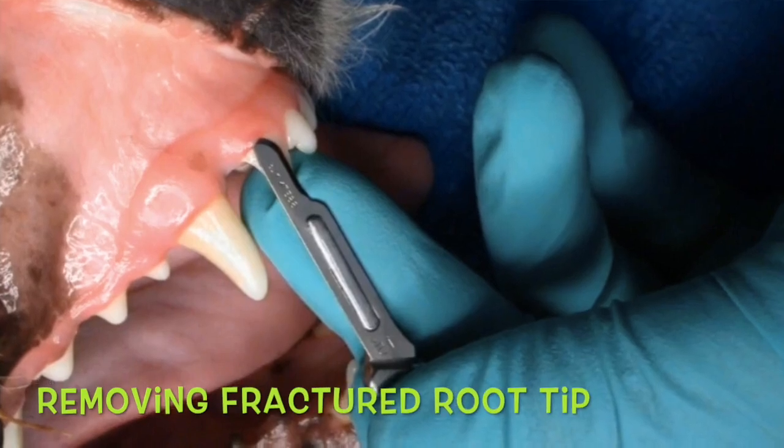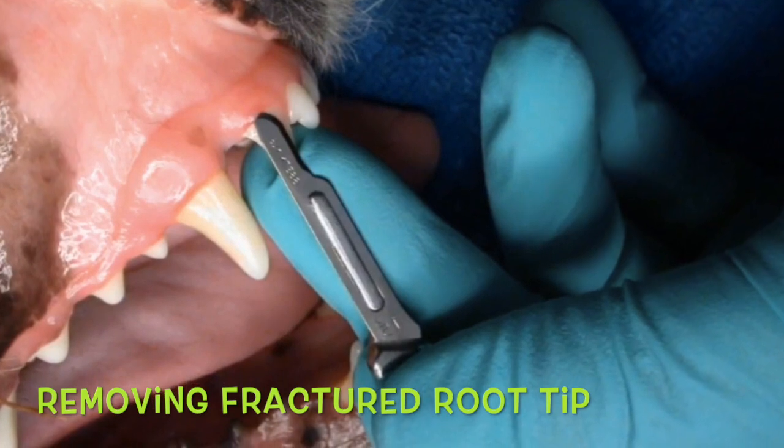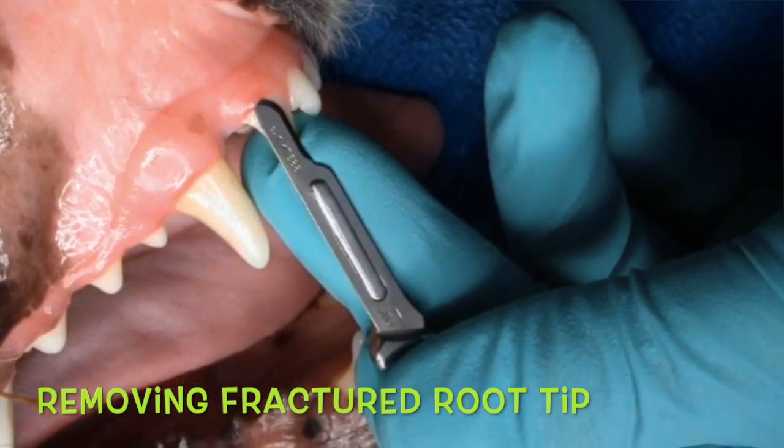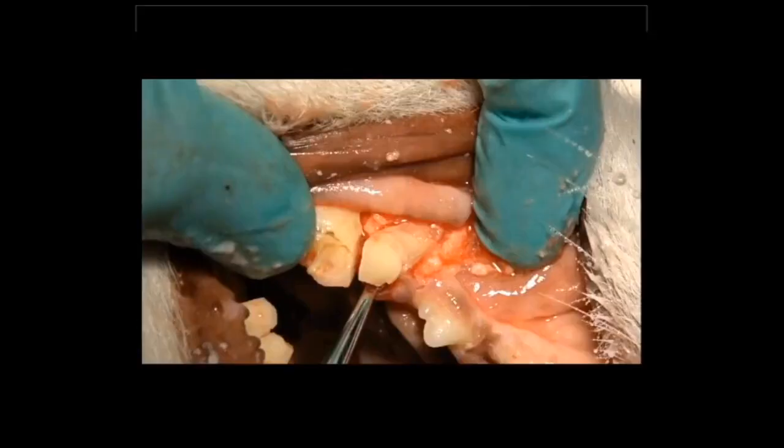How do we quickly and effectively remove fractured root tips? That's a question that we all run into. Everybody fractures root tips — I am not alone in that. I know you guys probably do that as well; I do it every week. So once we have those root tips, we've got to know how to get those out. This is a video that will demonstrate that.